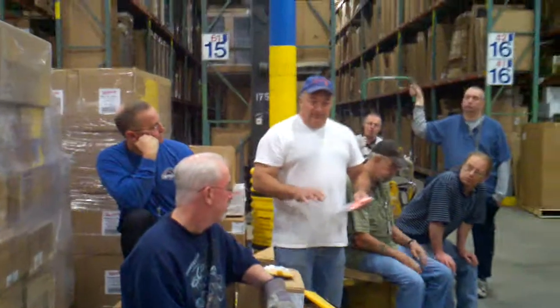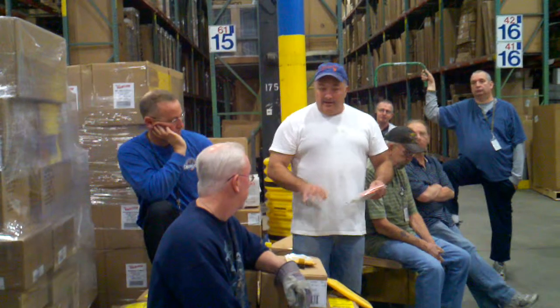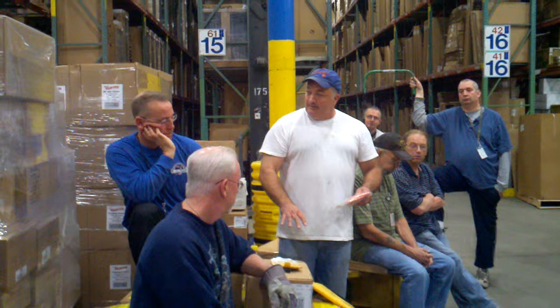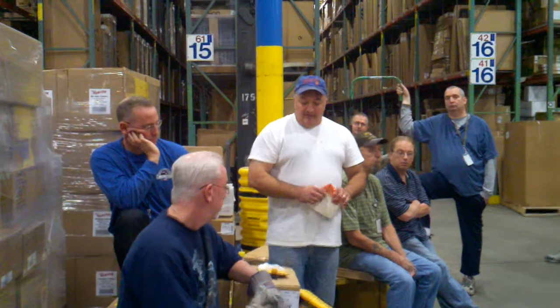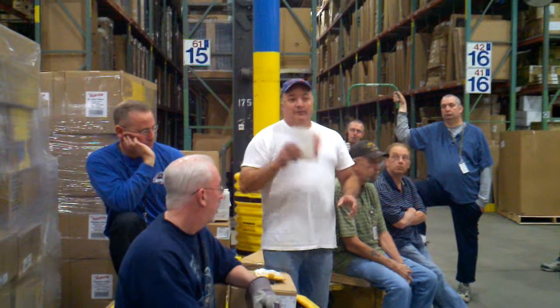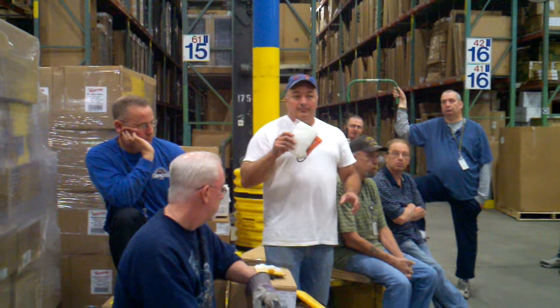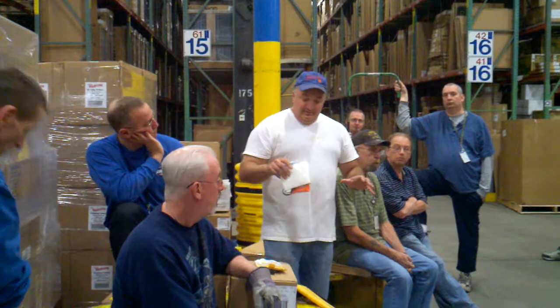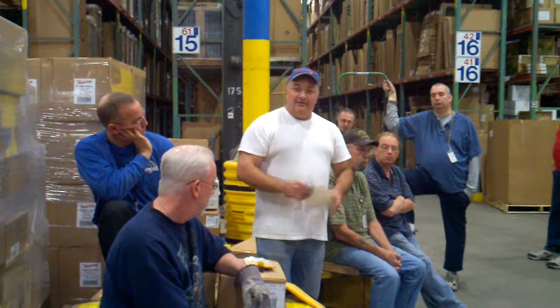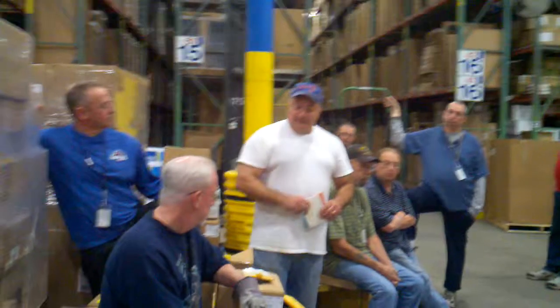If you're by yourself, put this on first. Get 911 coming and put this on before CPR. There are different scenarios. If there's a young child, they recommend 2 minutes of CPR before you start this. But for us here, first thing you do is get this on. If you have two people, one can be doing CPR. This is more important than the CPR if you're by yourself.